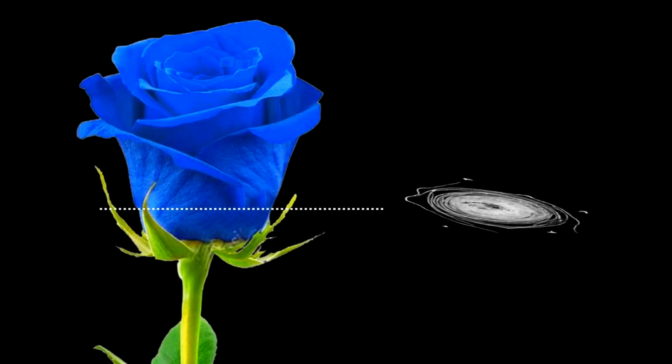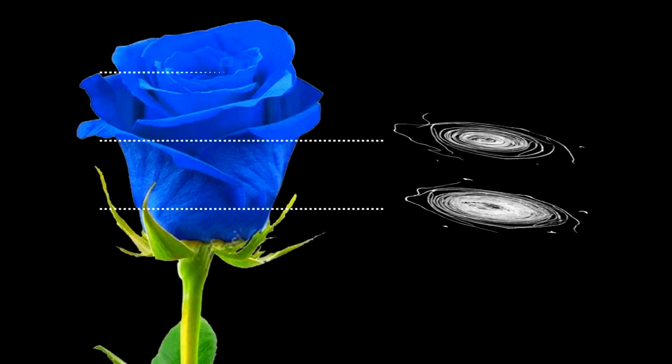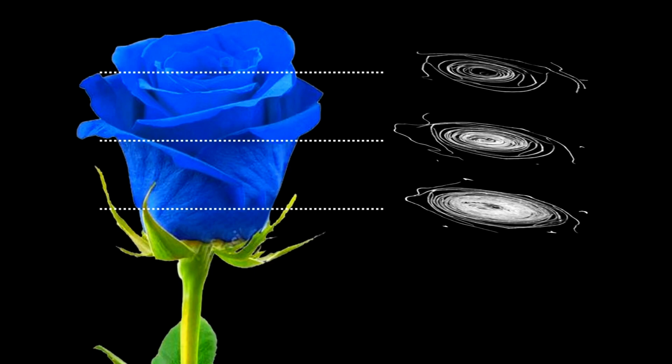So, let's first have a look at a rose where one wants to see the flower petals from the inside. With a computed tomography scanner, short CT scanner, we can reconstruct 2D slices from this rose. Stitching these 2D slices together will then give a 3D volume. For this rose, one can now see how the petals are structured, how they bend, and one could even count the petals without destroying the rose.